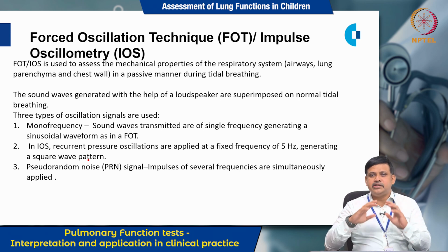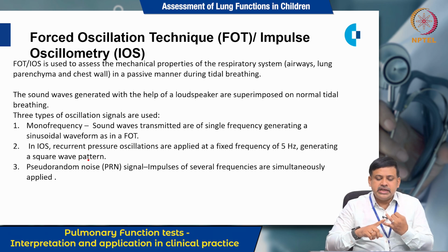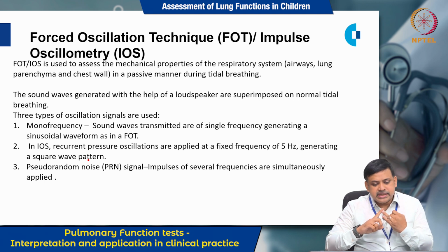It is like a passive manner during tidal breathing. Normal tidal breathing, you can do it. So, one thing is, 3 waves are very important here. The sound waves generated with the help of a loudspeaker are superimposed on normal tidal breathing. 3 types of oscillation signals are used.